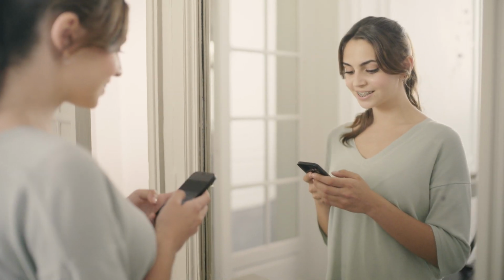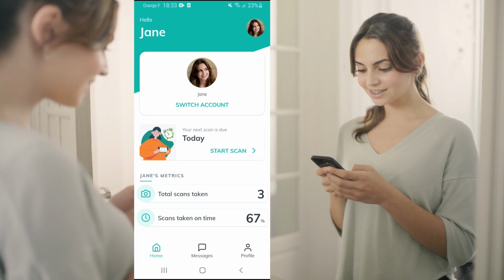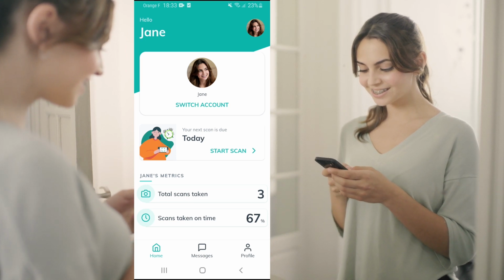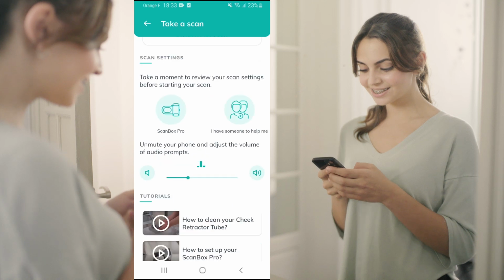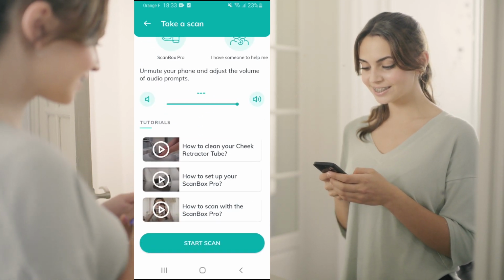Stand in front of a mirror. Open your application. The application is intuitive and will guide you. Press the Start Scan button and follow the instructions. Unmute your phone and follow the on-screen instructions.